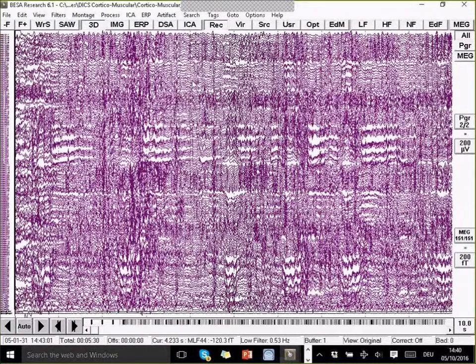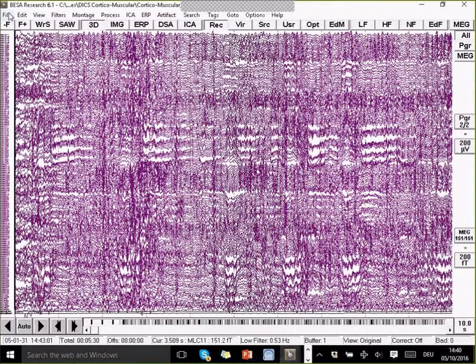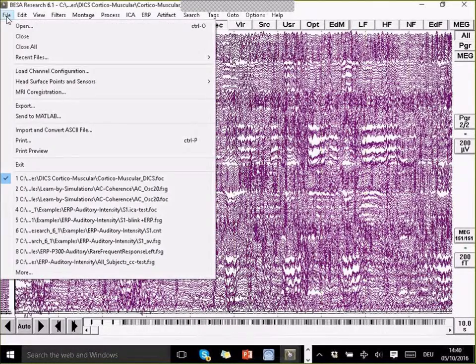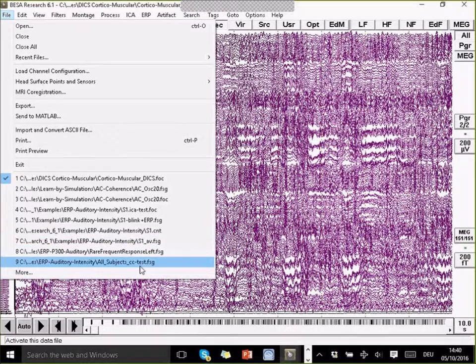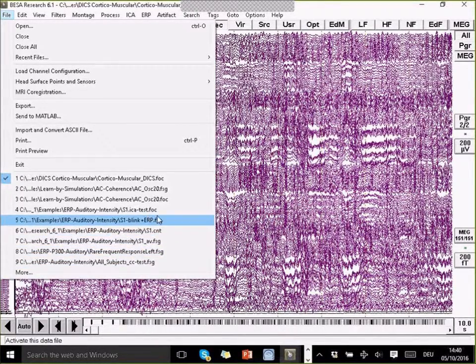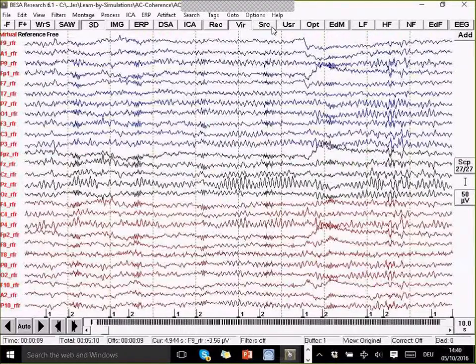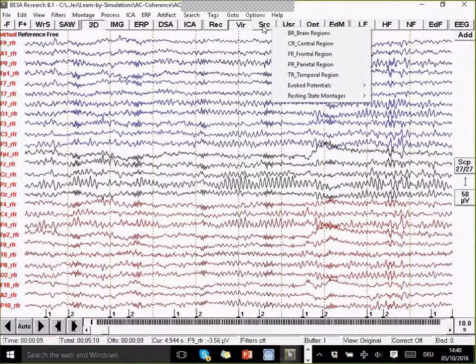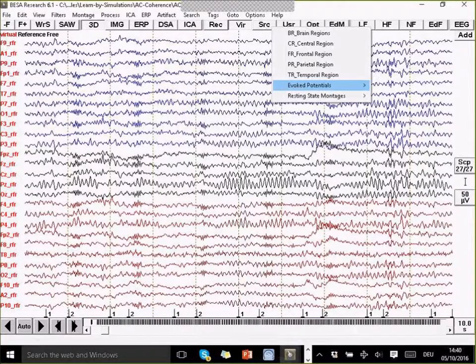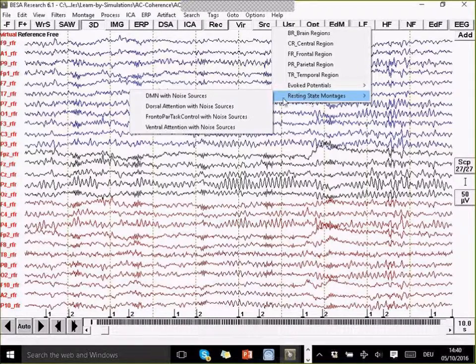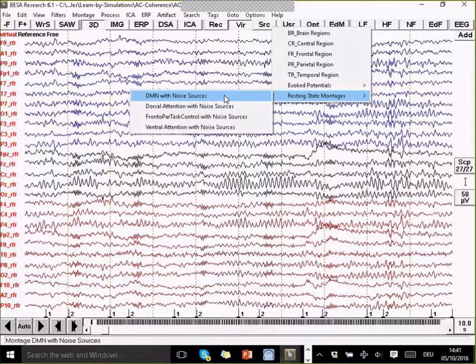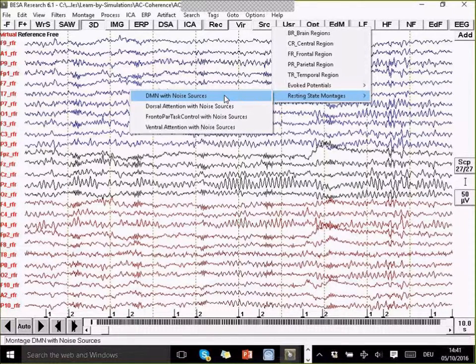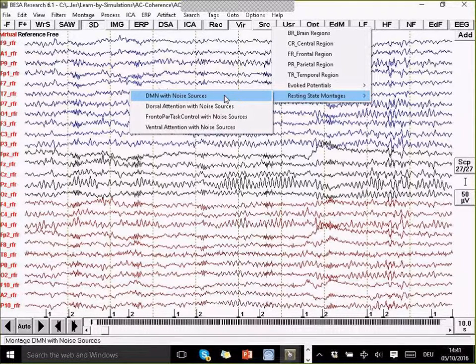For resting state, we have a number of new source montages available for resting state analysis. If I go back to this example file, we have a button here called SRC where our standardized source montages are kept. In this we have a subsection called resting state montages. We have optimized some source montages to analyze the default mode network and also three other networks that have been identified using combined fMRI studies.